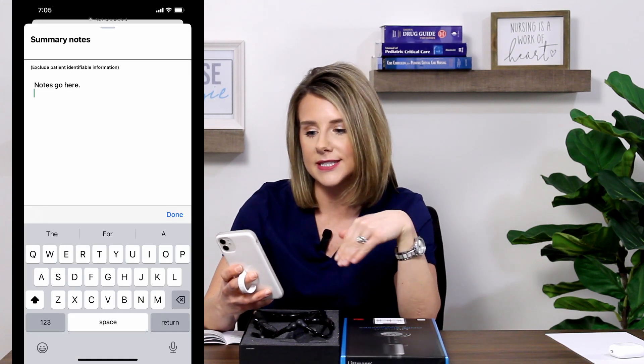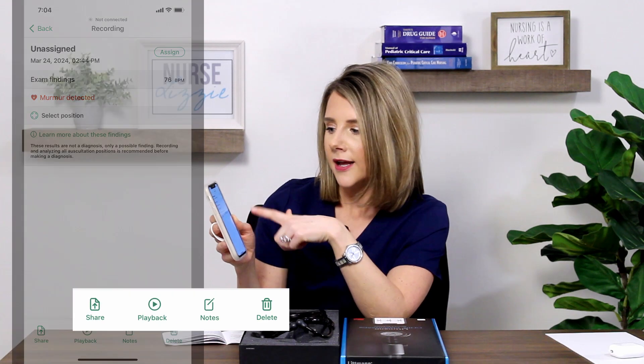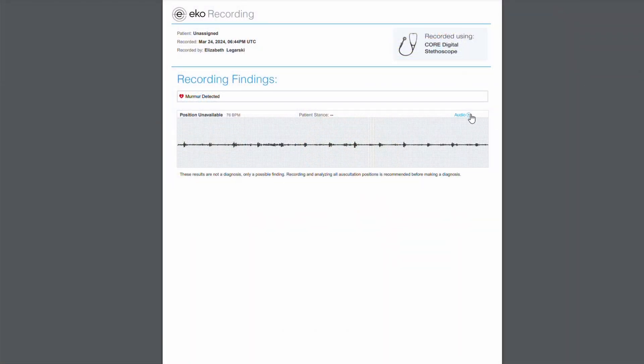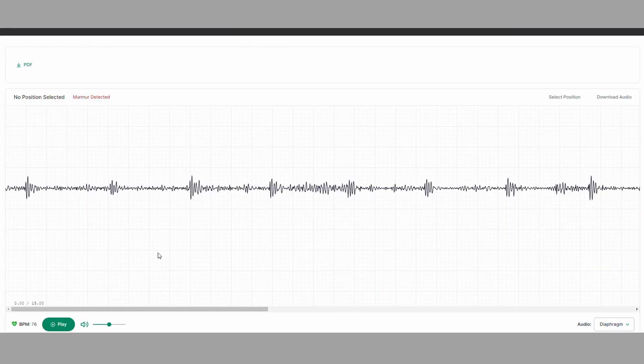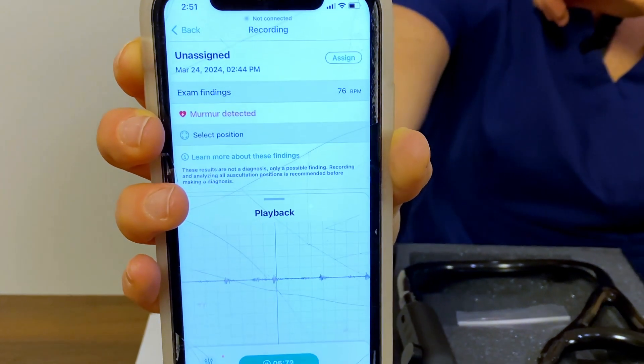What's even neater is that when you're in the app, you can actually hit record for the sound you're listening to. I can now share that sound with my provider at my next appointment. When you're in the app and you see a recording, you can hit share at the very bottom. It has the ability to send a PDF report to your provider — I can email it, I can text it — and it allows them to listen to the sound you recorded. How cool is that? I can hit play and you're able to hear back what I just listened to on myself.